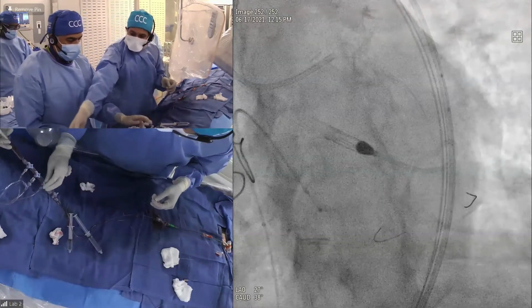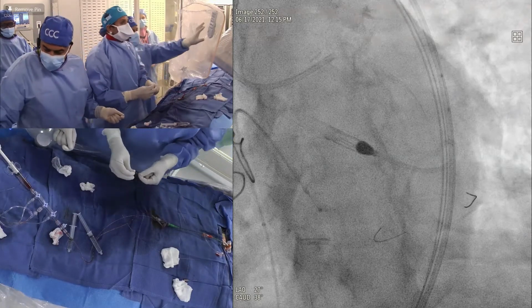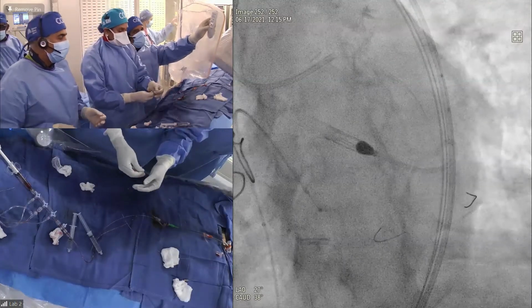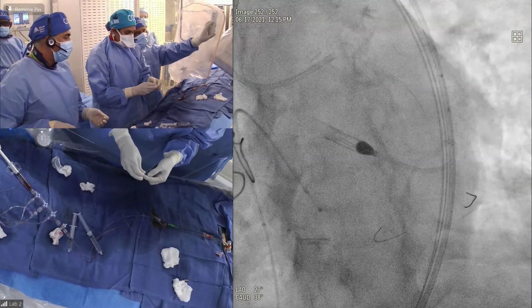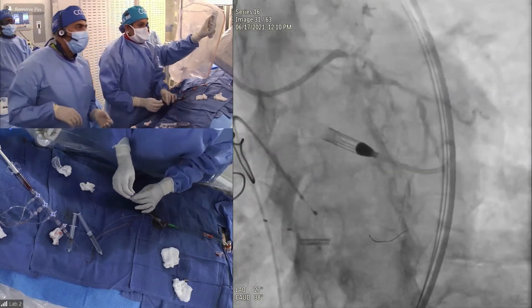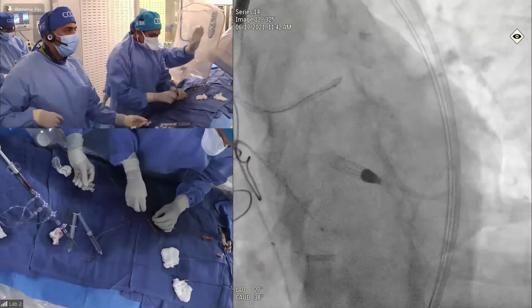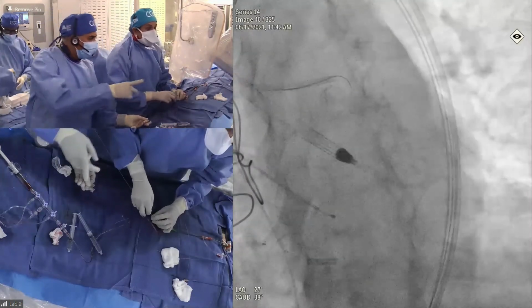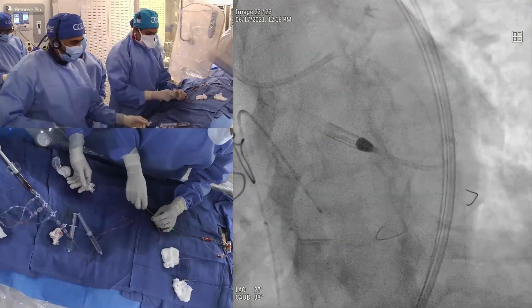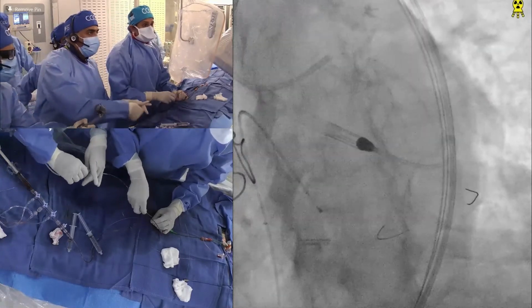2 or 12? Or you can, at the ostium of that OM, there was a disease also. Yeah, I think so. And we never rotoed down there in the OM. You mean rotoed the OM the other way. It's in that LPL now. No, my wire is in the LPL now, not in the OM. Yeah, and with the rotabur, we did go distal to the OM, but not to one. Well, that was from the 406. Okay. So we're going to the LPL.